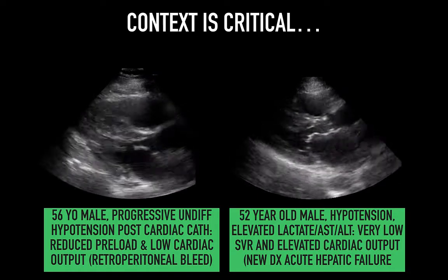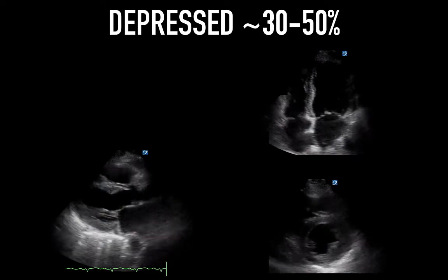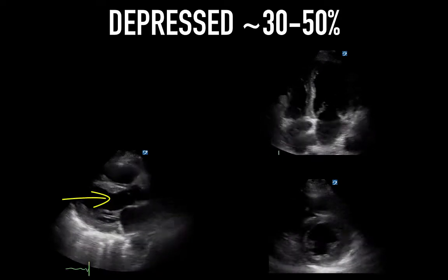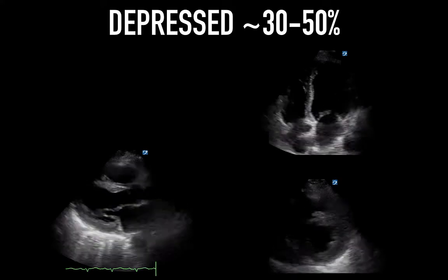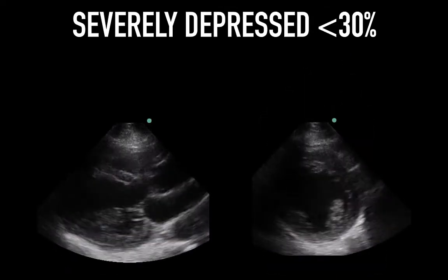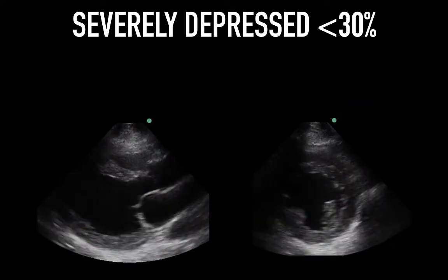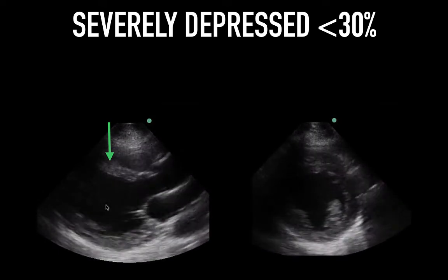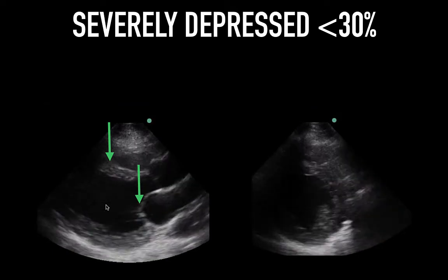This illustrates why context is so important to evaluating an ultrasound. Moving on to depressed LV function: we can see our multiple views with much reduced movement of the LV wall. You can also see reduced excursion and increased EPSS, as the anterior leaflet barely comes close to the interventricular septum. Discerning between depressed and severely depressed is challenging, but it really just requires you to look at multiple different images over time for your brain to be trained to recognize the subtleties of wall motion. We can see profound reduced wall thickening and virtual akinesis of many segments of the LV. Akinesis is a complete lack of movement. The EPSS has very reduced movement and doesn't come anywhere close to the interventricular septum during diastole.